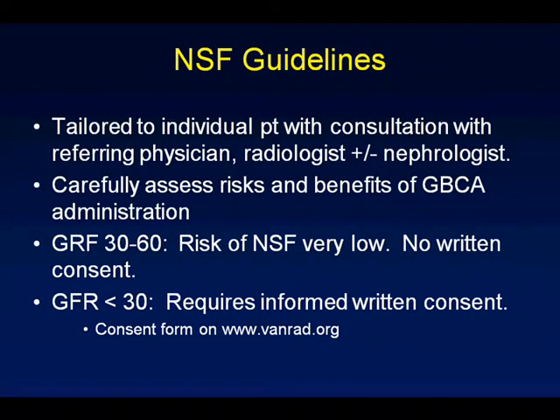So far in abdominal MR imaging, I haven't had to ask a patient for written consent. Most of the time we can get by without contrast, because with images on T2 alone, you can depict the pathology and figure out if the lesion is a simple cyst or very complex. And with MRI, it's non-radiating, so you can do frequent scans as follow-up. At least you've got a baseline.